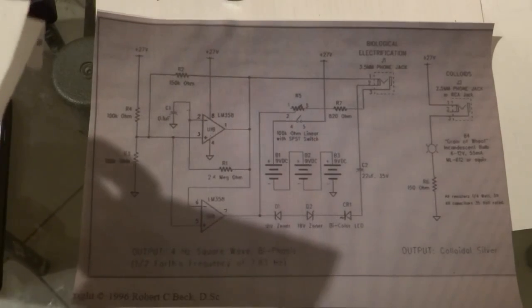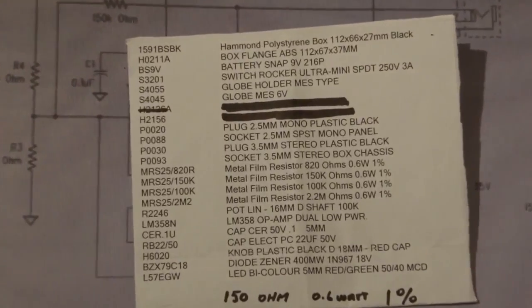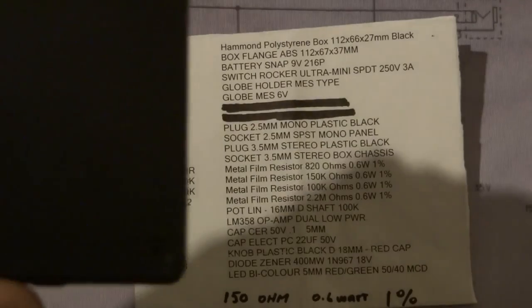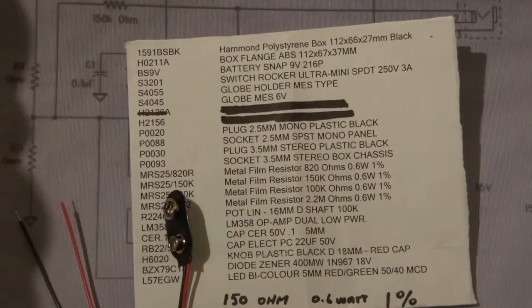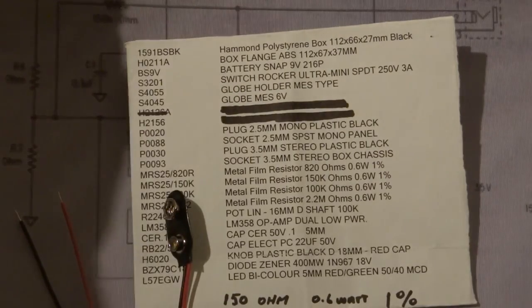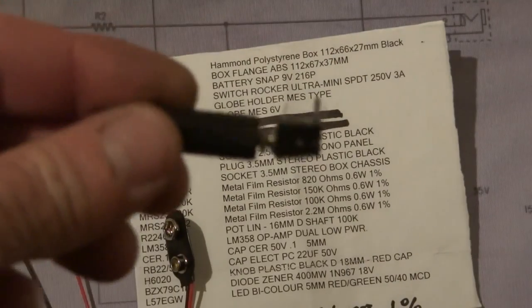I finally got around to building all the parts to make this device and show you how it's built. It's basically the parts list — I'll zoom in on that so you can see the whole parts list. What we've got here is basically a Hammond box or a flange box, and you'll need three of the battery snaps, a rocker switch, the globe and the globe holder, and the 2.5mm plug.